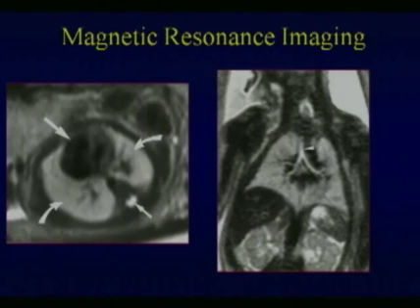We can also look at the lungs if there's any questions with magnetic resonance imaging, and certainly that has become much more prominent in the last decade. I'm going to be referring to MRI in these conditions that we're talking about because it can be a very helpful complement to ultrasound. Again, MRI can easily see the lungs.